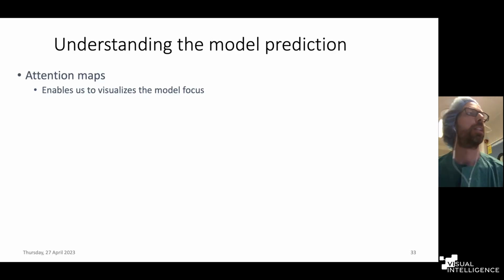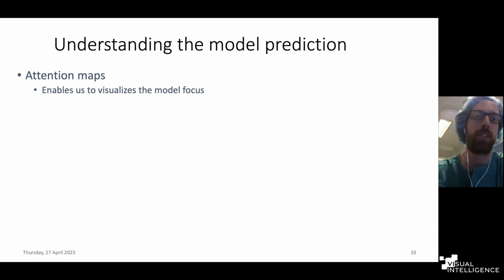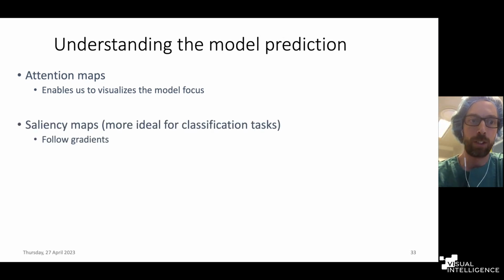But we still needed to develop a method to understand and interpret these predictions. So one way to do this is to use attention maps, which have to be baked into the models during training. And then you can see what the model will focus on.